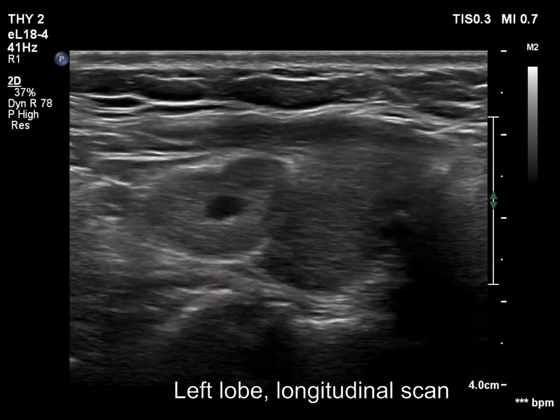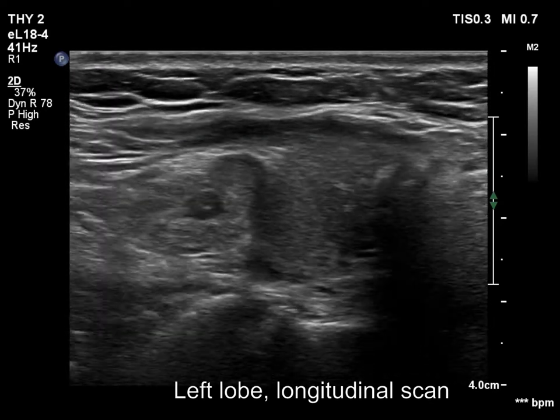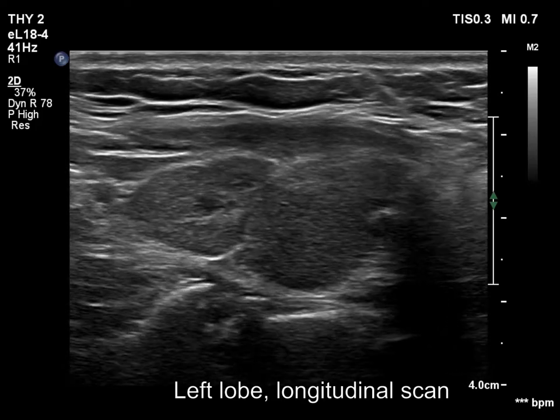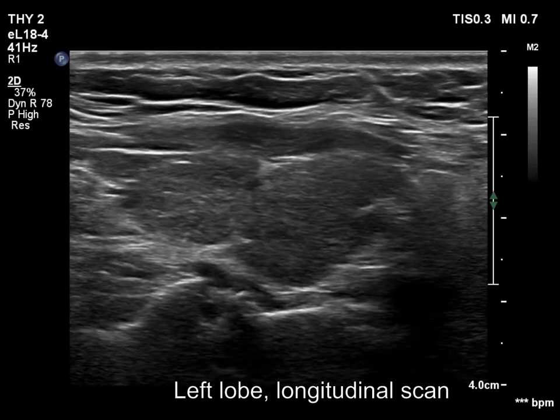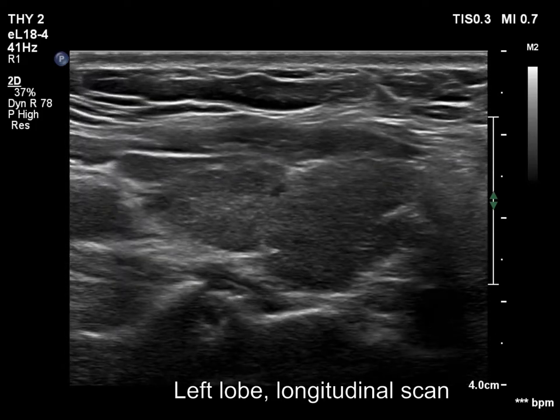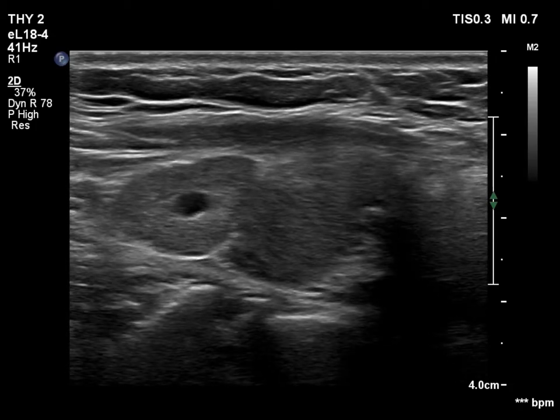It is to be avoided misinterpreting these parts as pathological nodules. The upper part has less hypoechoic areas and a cystic lesion.